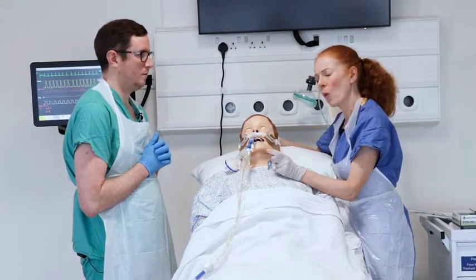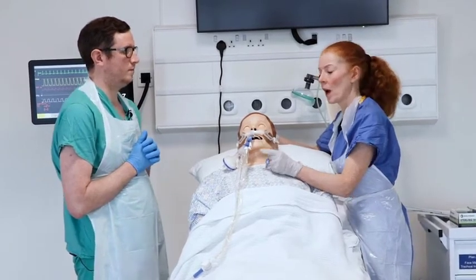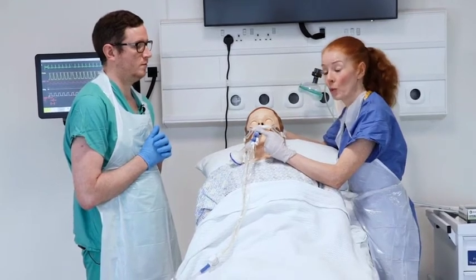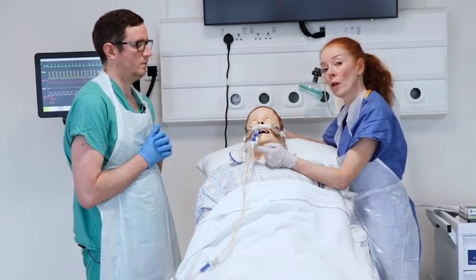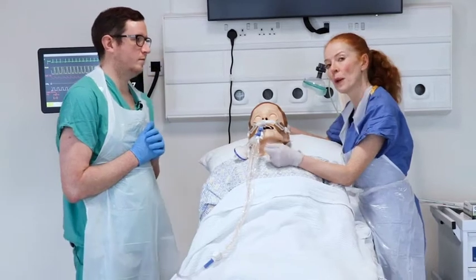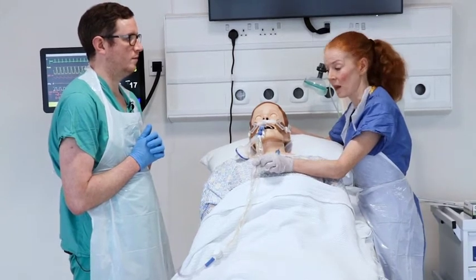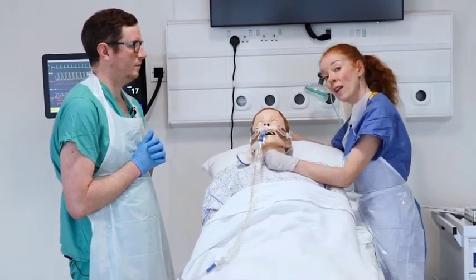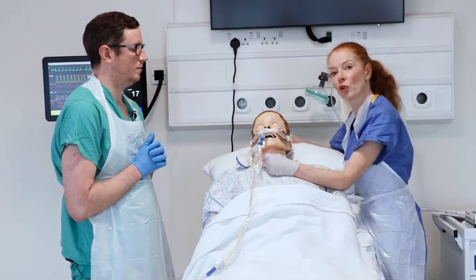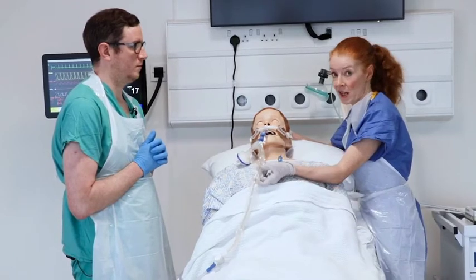First, you need to think about what size of suction catheter to use, which depends on the size of the endotracheal tube in situ. For a size 7 to 7.5 ET tube, use a suction catheter no greater than size 10. For size 8 to 8.5, use no greater than size 12. For an ET tube that is 9 to 9.5, use a size 14 gauge suction catheter.